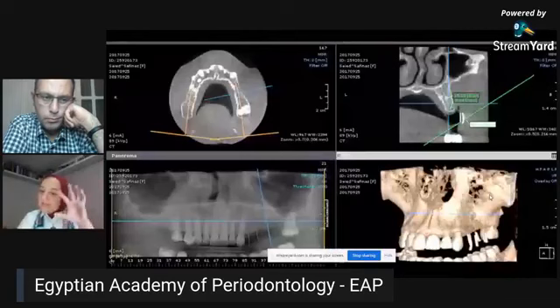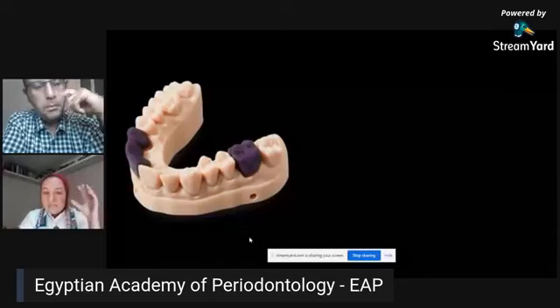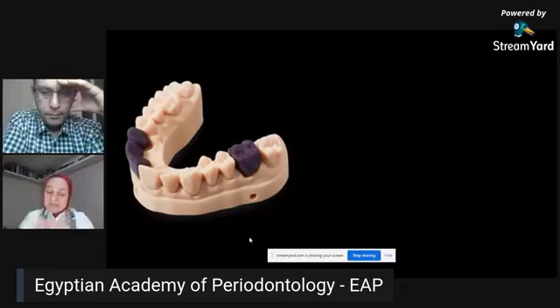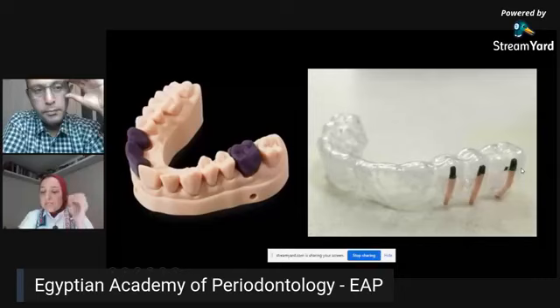As you can notice here, you can see some marks that we really don't know what this is, right? Something that's radiopaque on the x-ray. What we really do is that we put the teeth that we want to replace with very simple acrylic teeth and wax cementation. We fix the teeth with wax or any sticky material. And then we do a thermopress or a stent on these teeth. And we simply glue some gutta-percha exactly in the middle portion of each tooth that we want to replace. This is a very simple and cheap step to do.